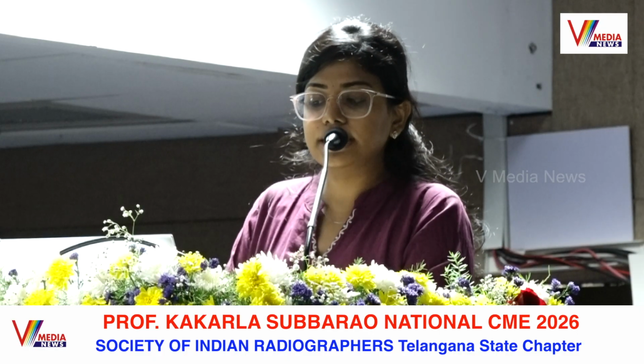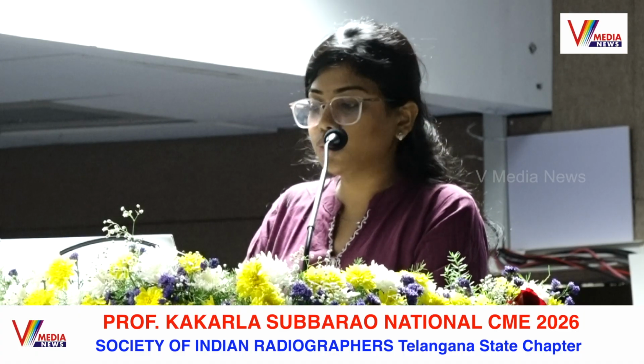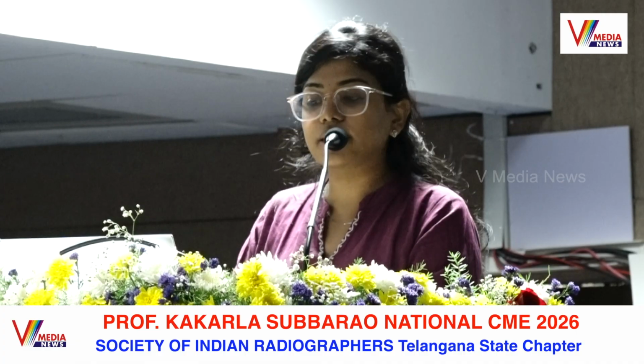The challenges in coronary CT angiography are that the vessels are very small in diameter, like 2 to 5 mm, and the distal ones reach down to 1 mm. So we need fine imaging, that is a spatial resolution of 1 mm. And we need fast imaging, temporal resolution, and coronary contrast resolution too. It is very mandatory. Coming to the calcium score, we are using the Agatston method to score it. Based on this, we can characterize the coronary plaque.